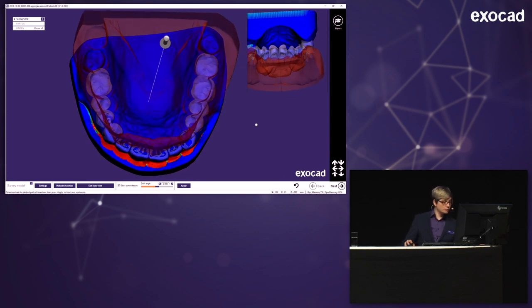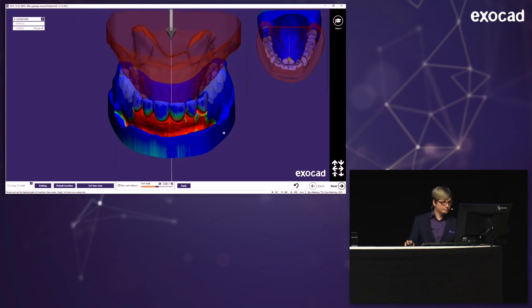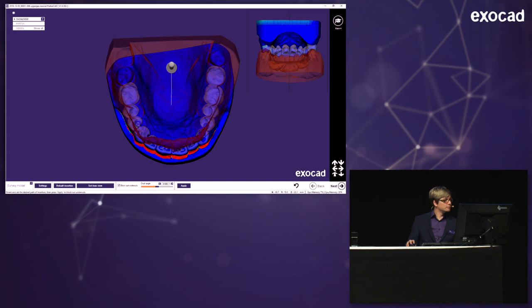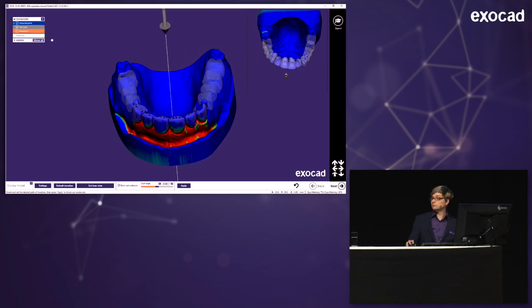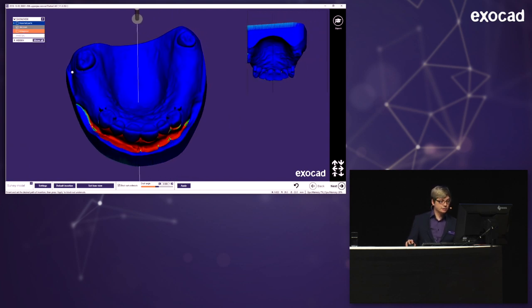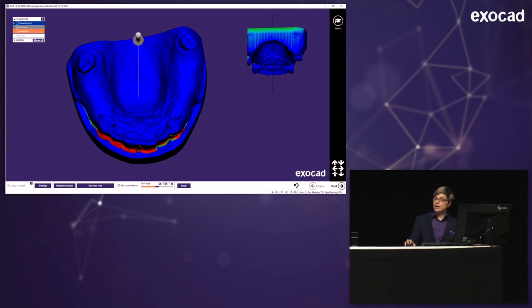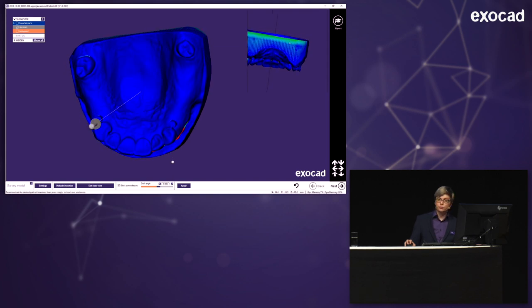The first thing is that you want to set your insertion direction for the partial framework. So I'm going to hide some parts for that, the antagonist, and also the imported parts, which are actually the bridges and the dummies we said before. You will be able to see them better later on. And I have to choose the insertion direction obviously based on the attachment part. So I'm choosing this one, set it from view. And here I can also activate the draft angle, and I'm going to activate one degree, is okay, I think.